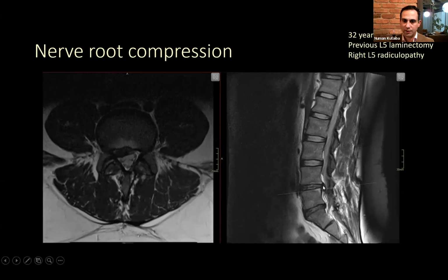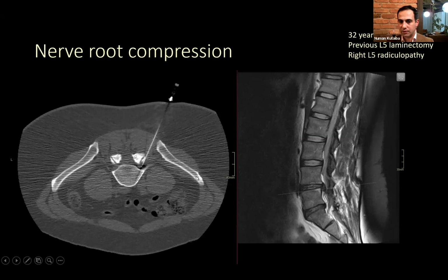And you do the MRI and there's disc herniation or disc prolapse with some extruded material, as you can see here on the axial image on the right side. If you focus on the left side, that's the nerve root traversing in this region without compression. The nerve root on the right side, you can't see it because it's completely compressed. Now, this patient will potentially require repeat surgery. However, neurosurgeons and orthopedic surgeons in general are fearful of repeating surgery on a spine that's already been operated on because of a lot of scarring and potential for recurrence.